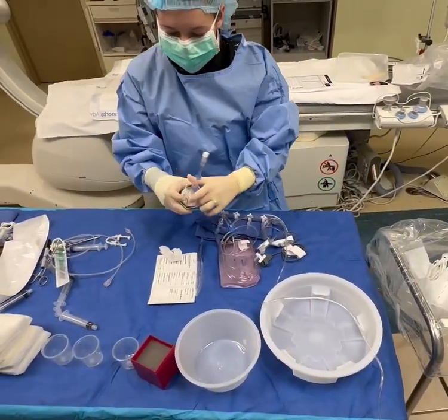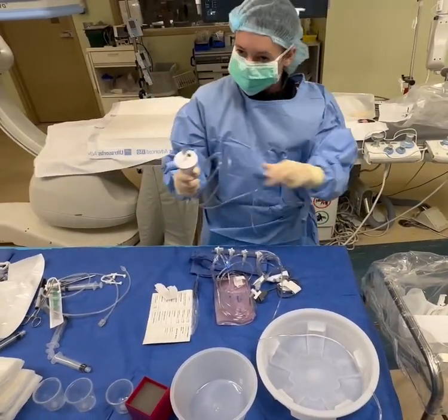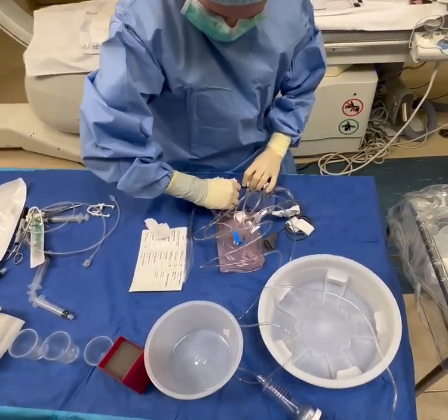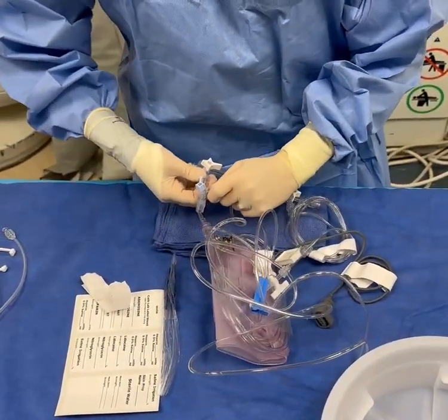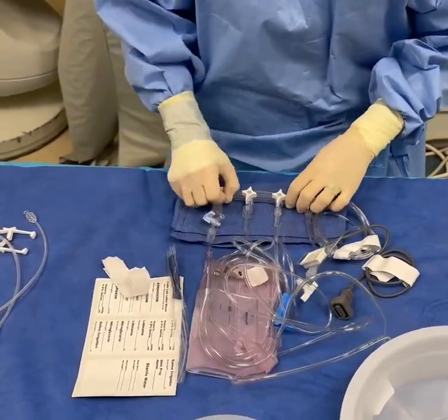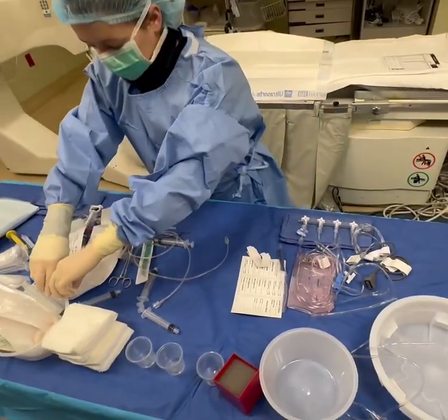This is my contrast burette. I'm going to take this cap off just to be nice to my nurse. I'm going to hand it off right here too. I'm going to make sure it's tightened as well. And this is my port where I can give IC meds, I can draw SATs, ACTs, but it's also my waste because I have a one-way valve, okay? These are clips. These just help you clip the drape down. We're going to go over that later.